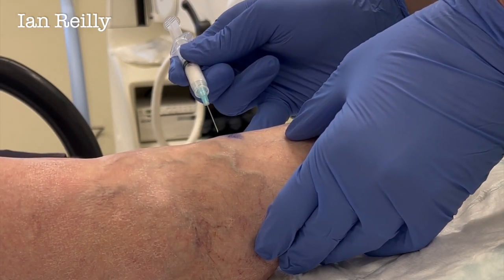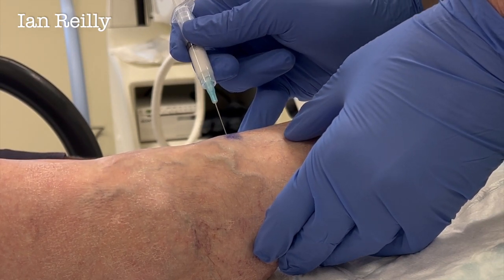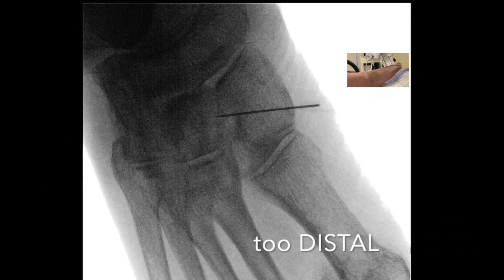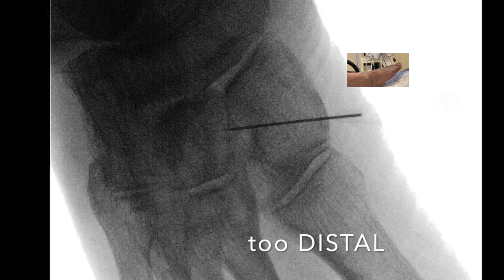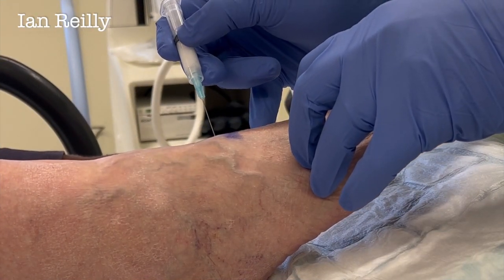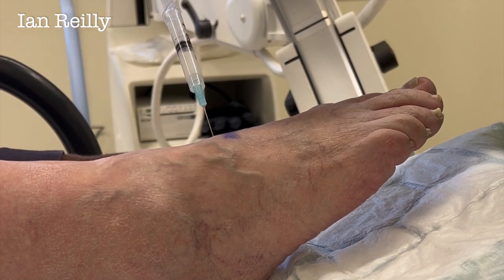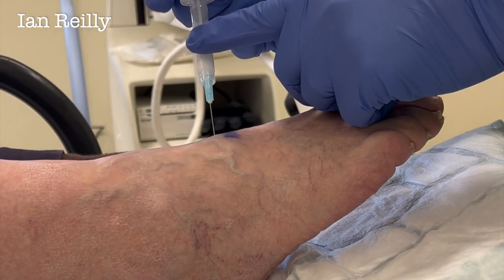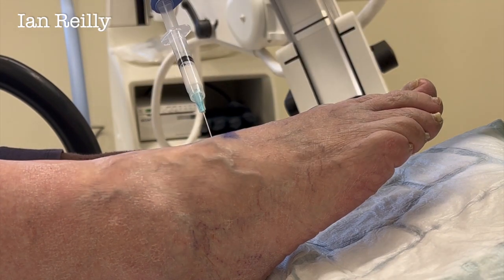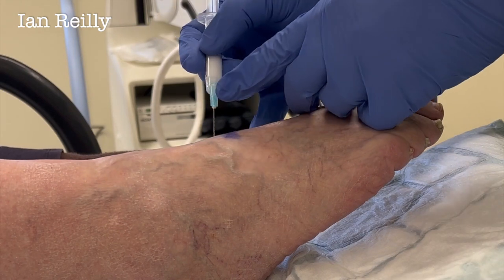So viewers, we've got a bit of Kenalog and a bit of local anesthetic. Chris, don't pull the face — it's fine. Three, two, one — scratch. We'll just do a little check to see how far we are. Miles away — another little scratch, no charge for this one. Three, two, one — scratch. There we go. Come back a little bit. Fingers out of the way. Yeah, a little bit more.